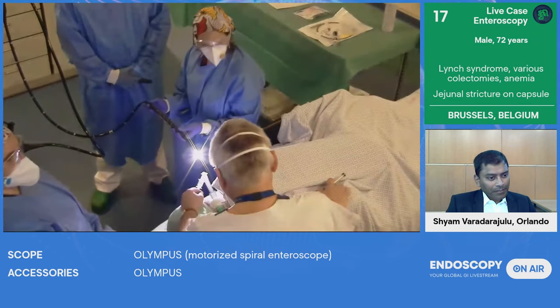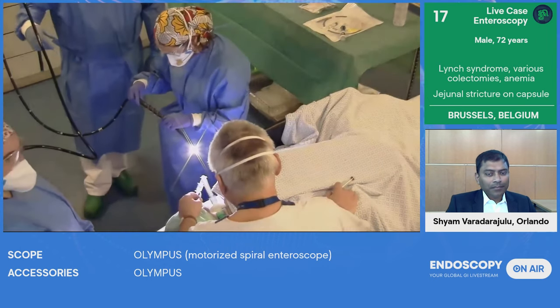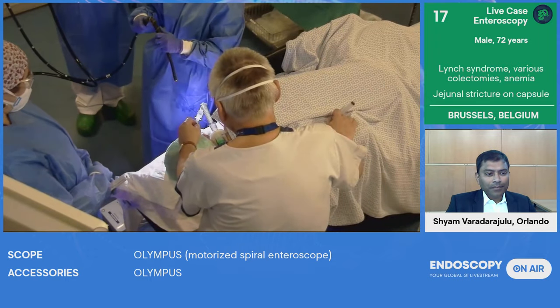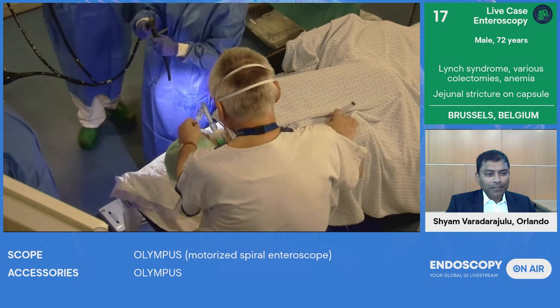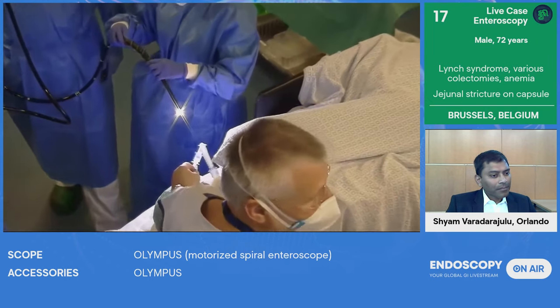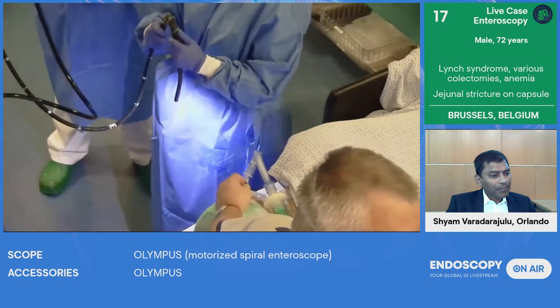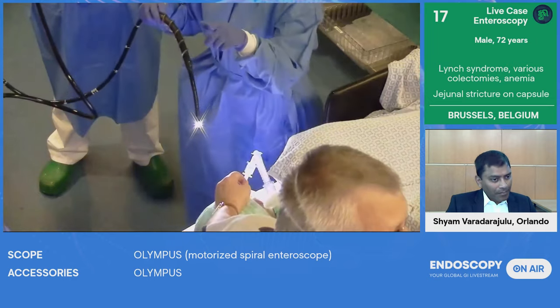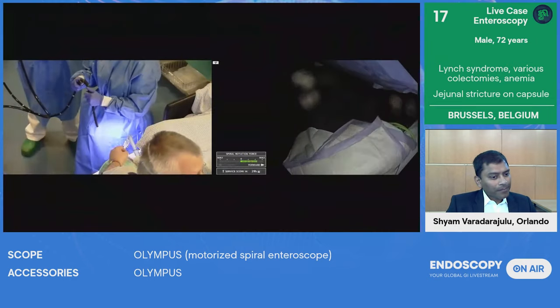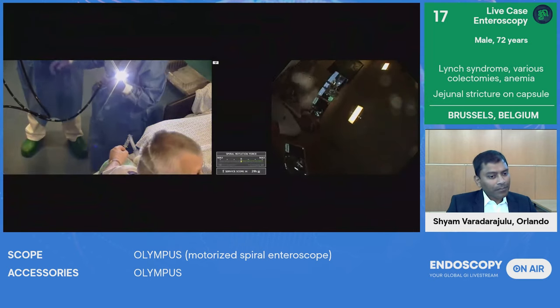We already dilated, and here is the device. So what we do before is checking the movements. This is backwards, and we see that there is a security system where if I have too much resistance, the system stops, and it's embedded in our screen, and also the forward. And we see that both directions are moving. And now we're going to introduce the scope.